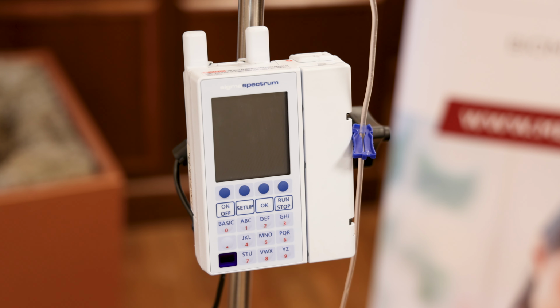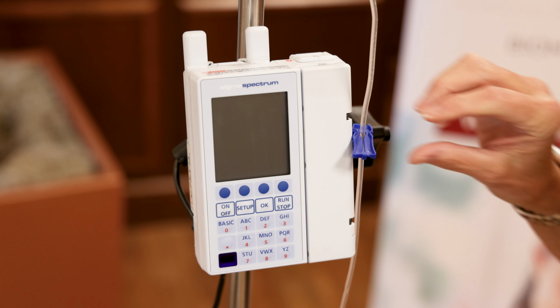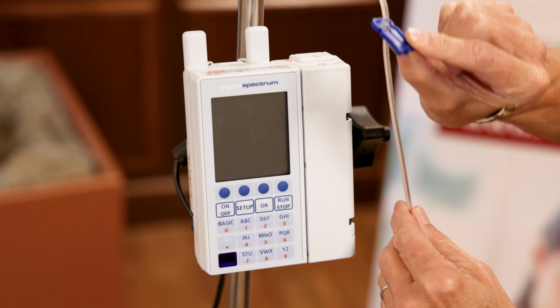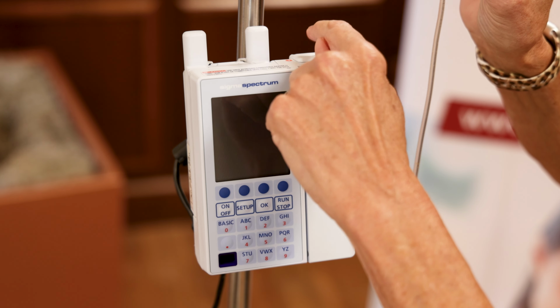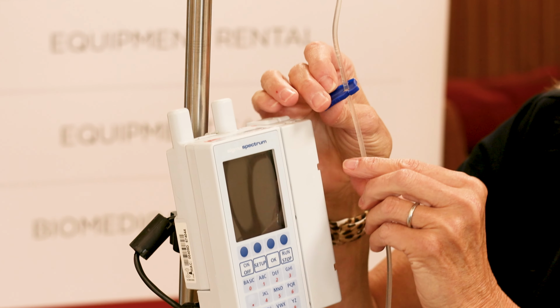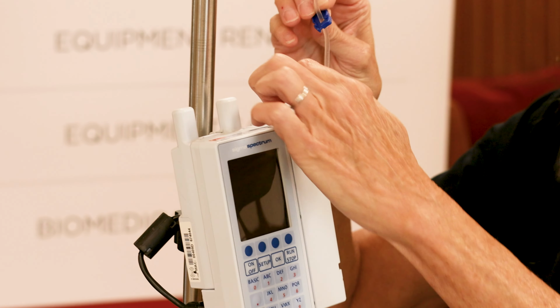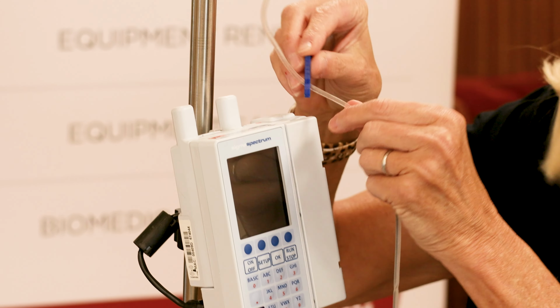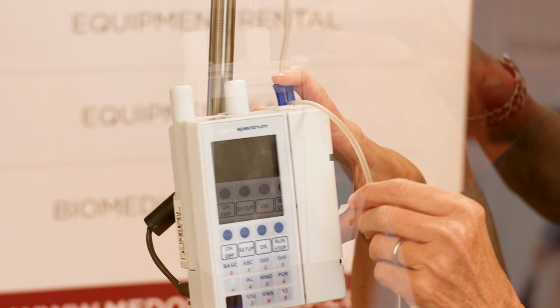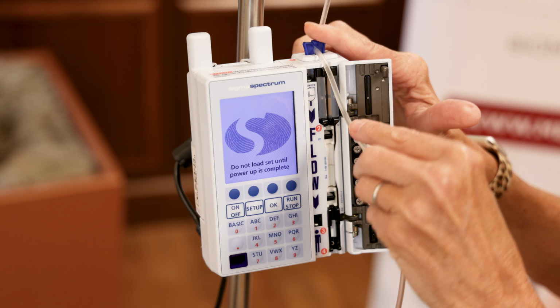So now we're going to load the device. Each of the Baxter sets have what's called a key, and it's blue. The key fits on top of the pump, and it's a keyhole where it fits in. And you'll notice there's a notch, and you want to make sure you line that notch up with the notch in the keyhole. So I'm going to slide it down, load it into the keyhole, and it will open up the device for you.